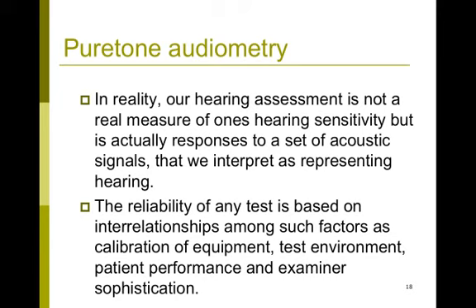One thing you need to be acutely aware of is that when we're doing pretty much any behavioral assessment, what we obtain is not actually a real measure of one's hearing sensitivity, but it's actually the patient's response to a set of acoustical signals that we give to them and that we interpret as hearing. Okay. So in other words, there are a number of variables that affect our test results, and that's what we're going to be talking about in the next few slides.